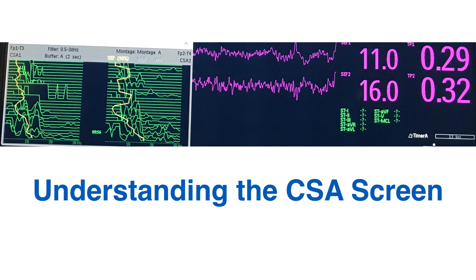Next to the raw EEG you have values for SEF — spectral edge frequency — and TP, total power, with numbers 1 and 2 corresponding to left and right sides. You also have two graphical displays side by side — these are the actual CSA, or compressed spectral array. CSA1 is between the left-sided electrodes and CSA2 is the right-sided electrodes.